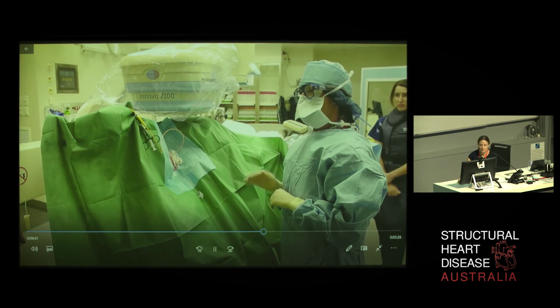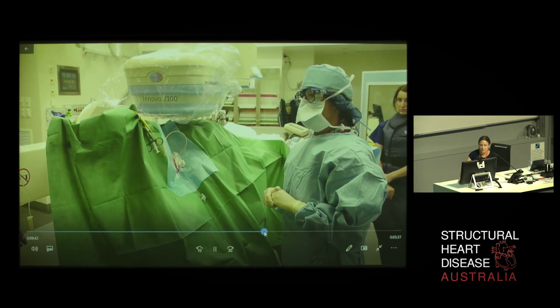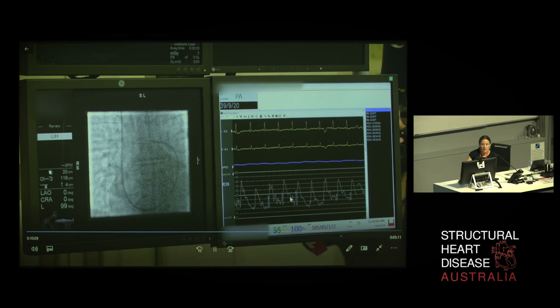A little bit of pressure. That looks like a really good trace. I'll keep going. There's a pulmonary artery trace here, a tiny little flick with a notch, but otherwise we can see it coming through, and we're getting a nice PA pressure of 20 in this PA case. We grab 3 recordings from there.